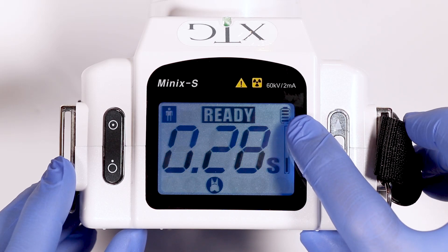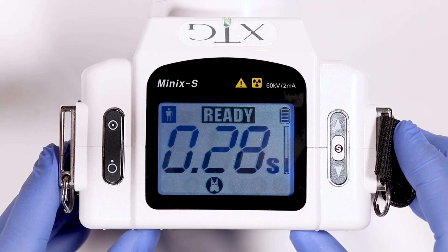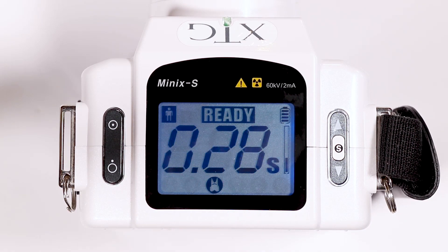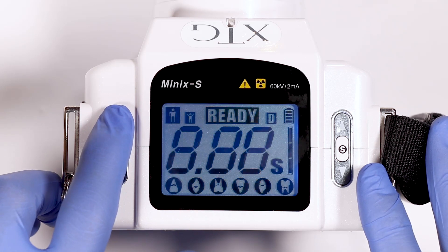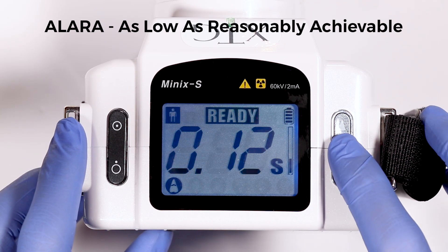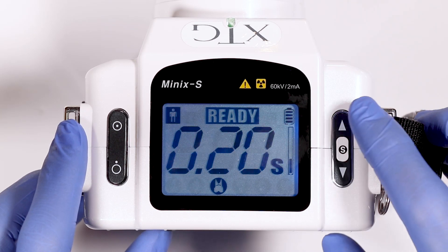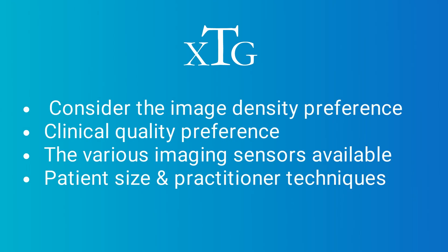The battery life is shown in the upper right side of the XTG with four bars showing full battery life. You should receive about 150 exposures throughout the day before the battery needs to be recharged. The factory settings on XTG are set as a starting point. When deciding on the appropriate time settings, remember the ALARA principle — as low as reasonably achievable — meaning set the exposure time as low as possible while still achieving an appropriate diagnostic exposure. Consider image density preference, clinical quality preference, the various imaging sensors available, patient size, and practitioner techniques.